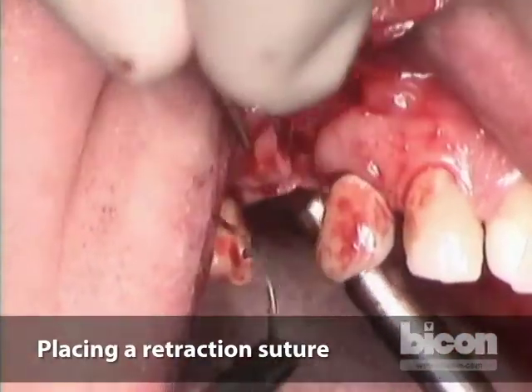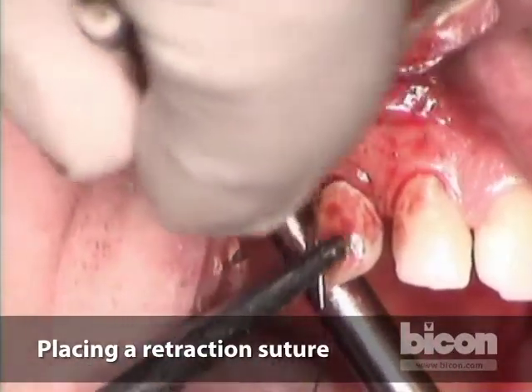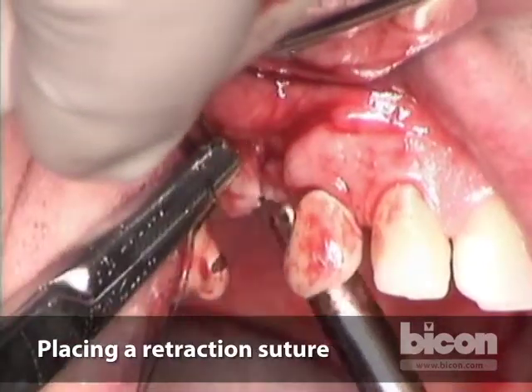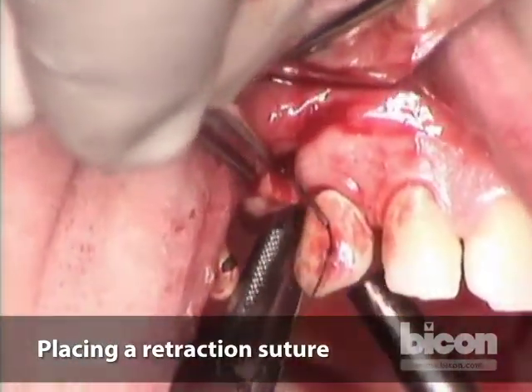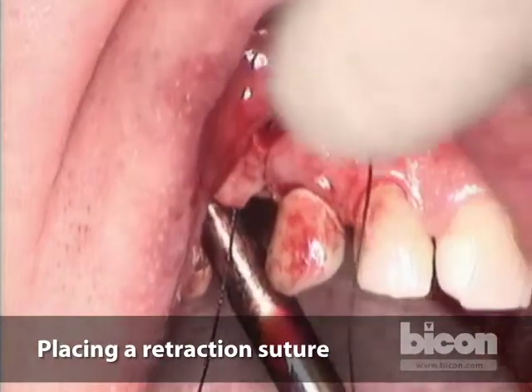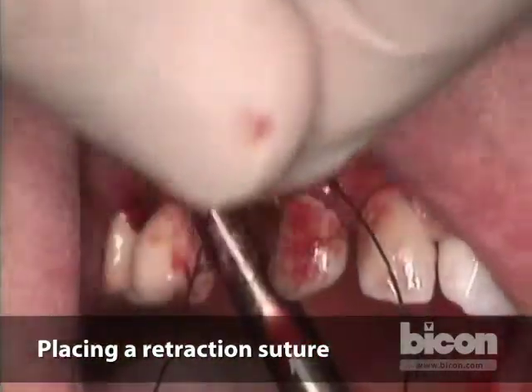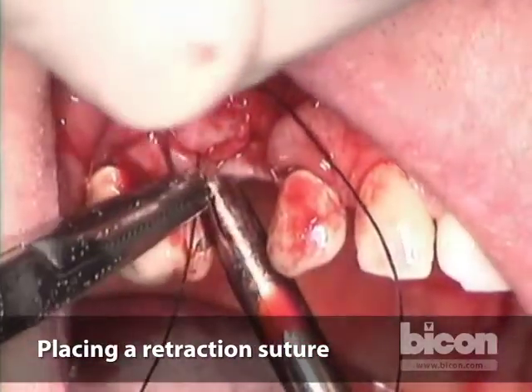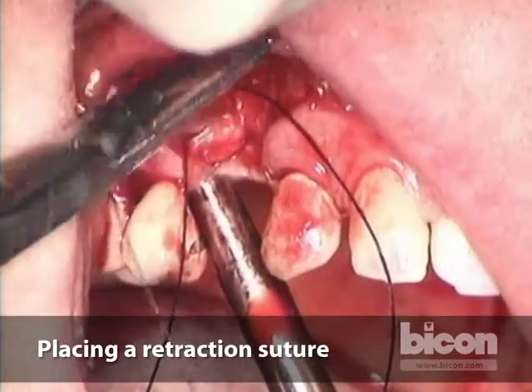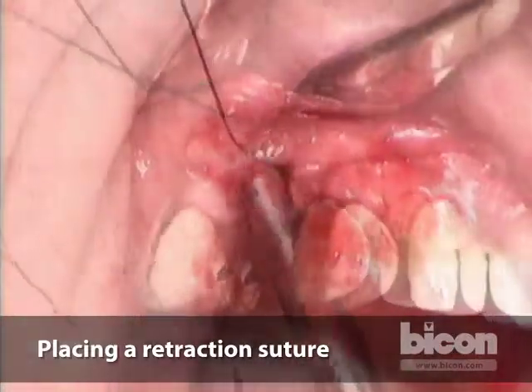Okay, good, thank you. We'll take a bite. I try not to pierce the gingiva too many times. There will be plenty of these punctures when we're suturing. So I'll just take it from the thick part, the submucosal part, and then we will tether it to the outside, to the cheek mucosa.